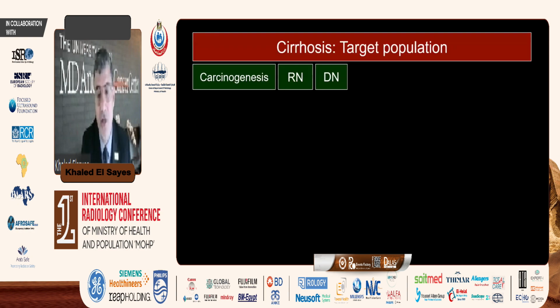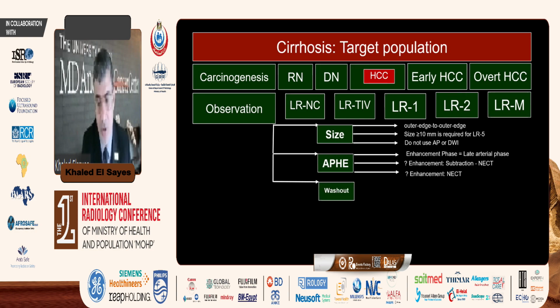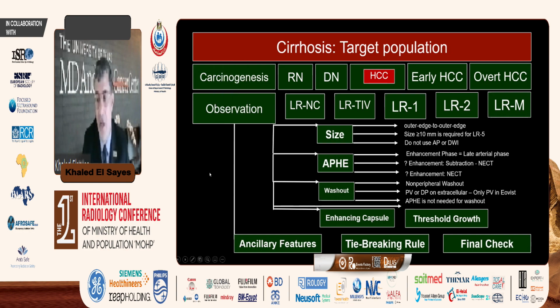And here is my take-home slide, which is very important. I went over all of these in my lecture: definitions of major features, and pitfalls. And hopefully, with using all of this, you will be able to reach diagnosis, and you will be able to avoid the pitfalls and characterize an enhancing observation in a cirrhotic liver.